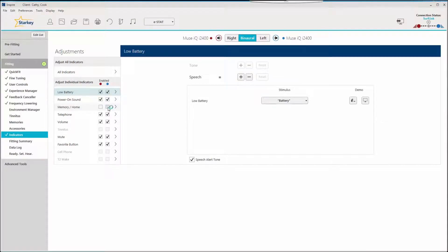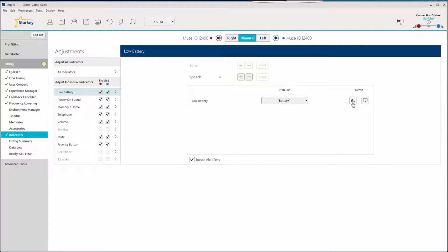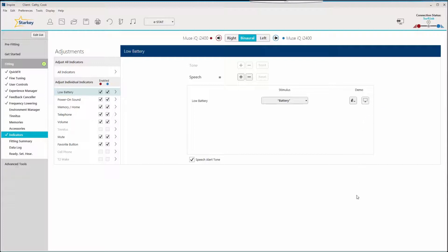For specific indicators, click the indicator name. Each indicator can be demonstrated through the hearing device via the device icon or through the computer loudspeaker via the computer icon.